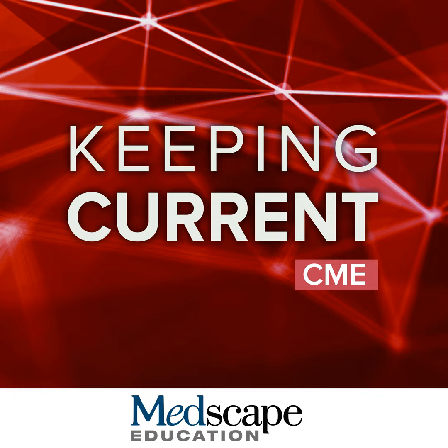The reason why this is so, gadoxetate does improve lesion conspicuity. You can see this is the same case, arterial phase and portal venous phase with extracellular contrast agent. We can see this lesion, but you can see the contrast between the lesion and the background parenchyma is not stark, as opposed to hepatobiliary phase, where the contrast between the lesion and the background parenchyma is very, very obvious. So it becomes easier to detect these lesions.